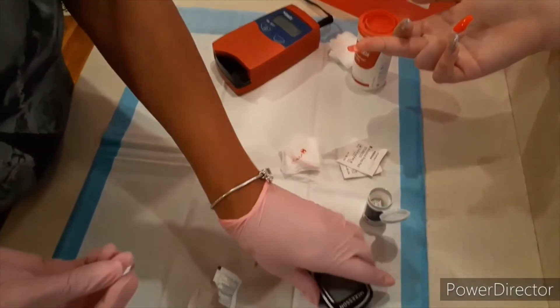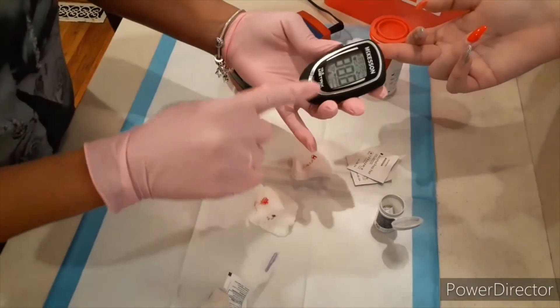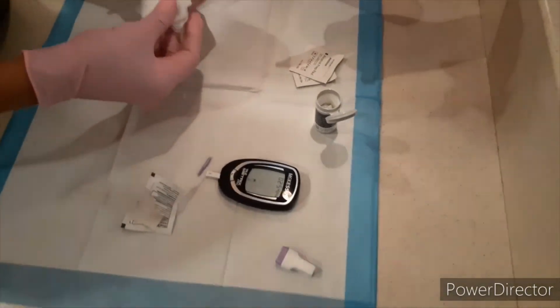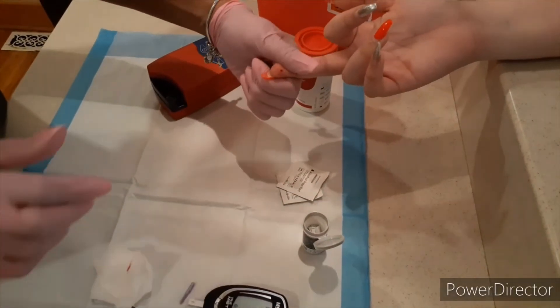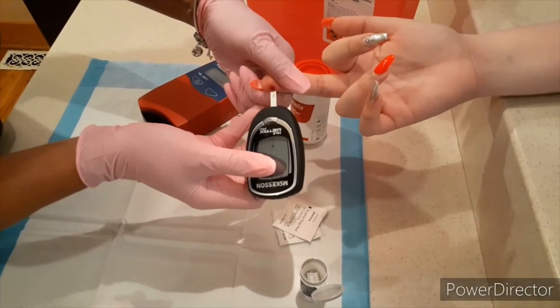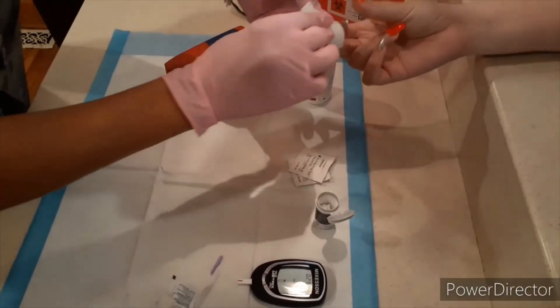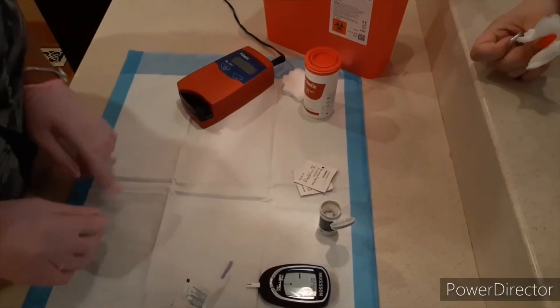Then I'll take my test strip to get ready for my glucose. You'll see a drop of blood signaling that it is ready. We'll squeeze again — just for safety, I'm going to wipe off that first blood. We don't want to touch the instrument to the skin, only to the blood, and lay on a flat surface for our results. We'll have the patient put pressure on their finger and document our results when they're ready.